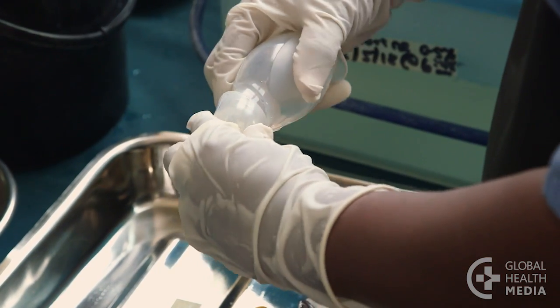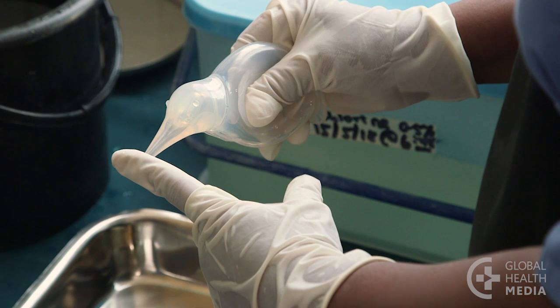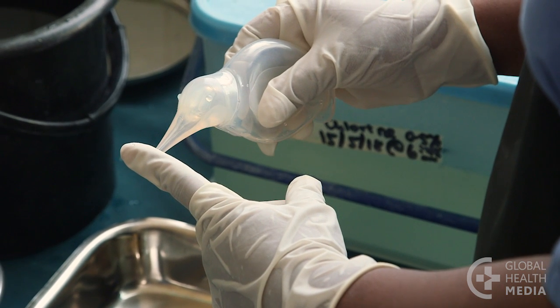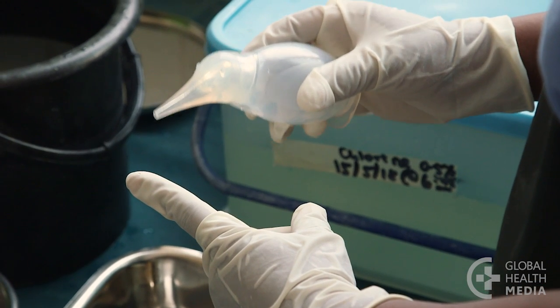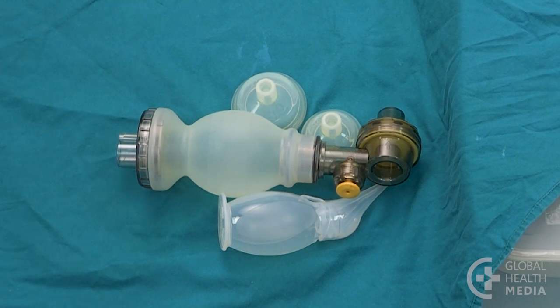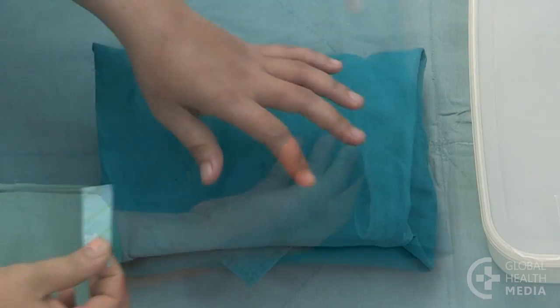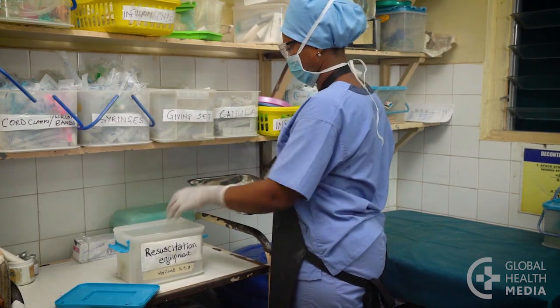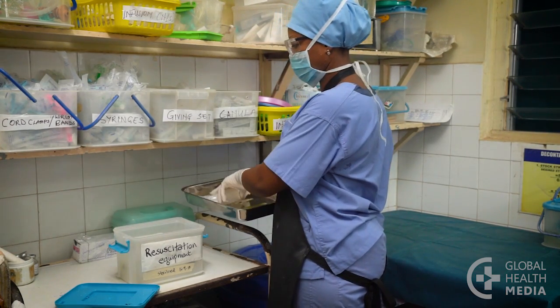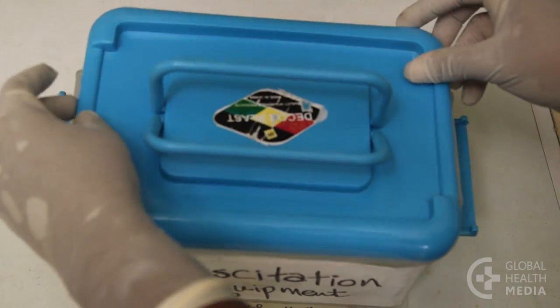Then, test the suction device. Squeeze it, block the tip, and release. It should not expand until the tip is free. To store the equipment, either wrap it in sterile linen or place it in a plastic or metal container that has been disinfected. The lid should fit tightly.